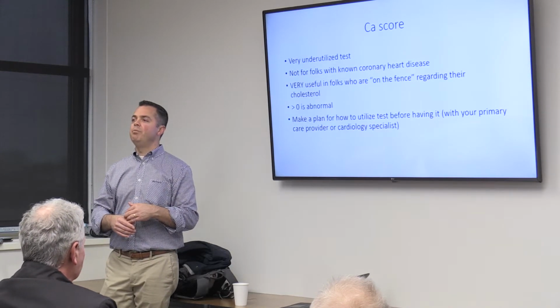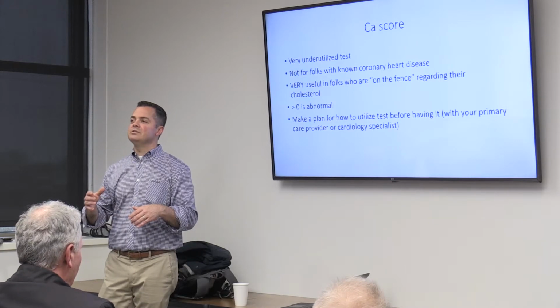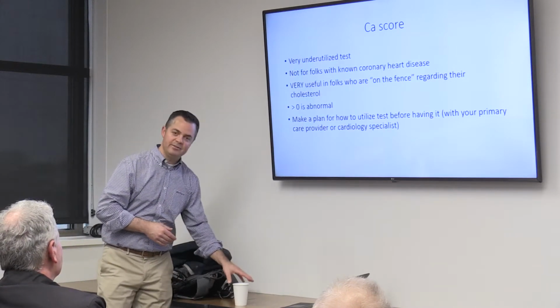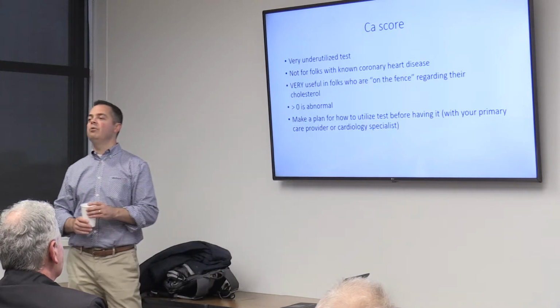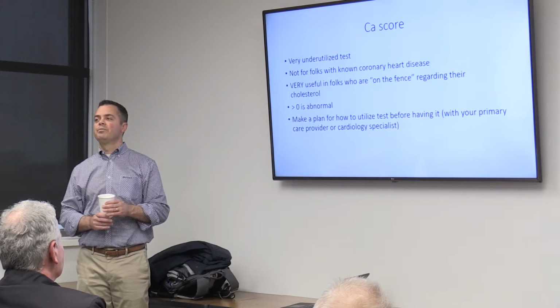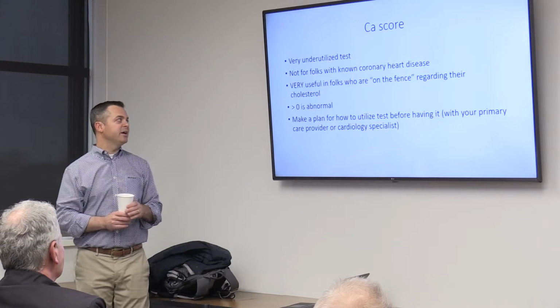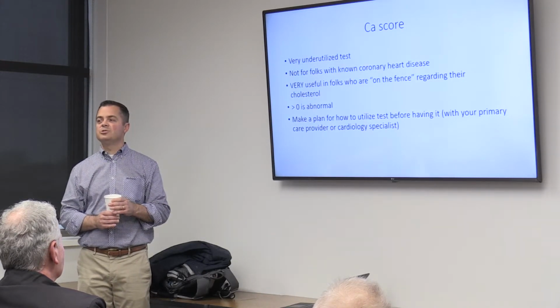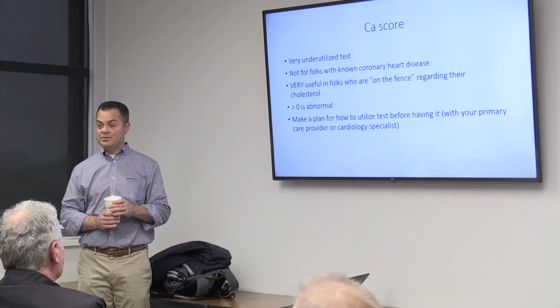But the big question isn't how it's done, but who should have it. Because a lot of people ask me, should I get a calcium score? So the short answer to who should have it is definitely not people who've already had heart disease. Not people who've already had heart disease.